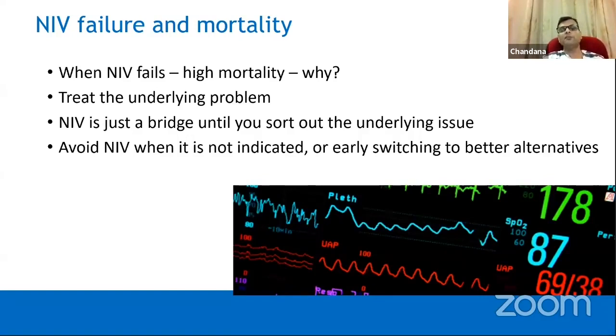So it's a trial and error method. When you fail giving oxygen, and if there is no high flow device or any high oxygen device, you can try the domestic BiPAP devices and try to ventilate this patient. If the oxygenation is not adequate, try to use the maximum flow available on the flow meter, ideally a 30-liter flow meter.